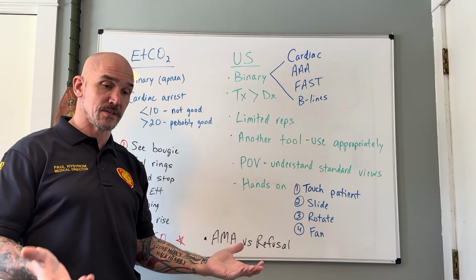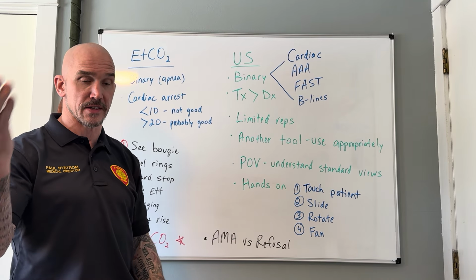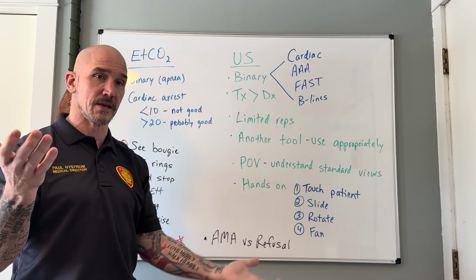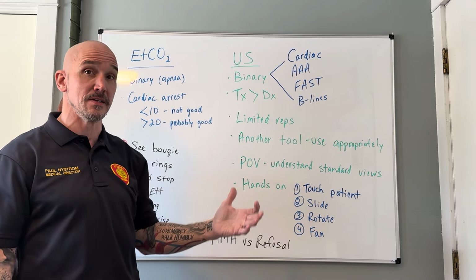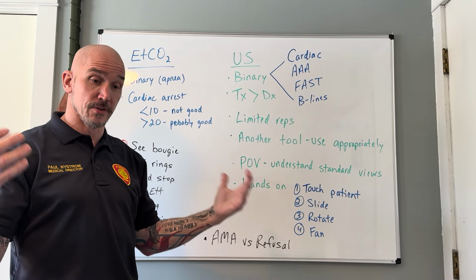Giving the wrong treatment to a patient, in terms of either a nebulizer for CHF or giving nitro to somebody with COPD, is not the end of the world, but ideally we're giving the right treatment to the right patient. Most of the time when those patients are the sickest, they need CPAP. So use the CPAP for those patients.